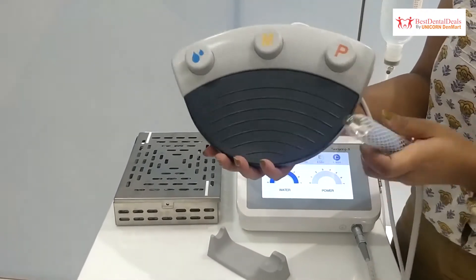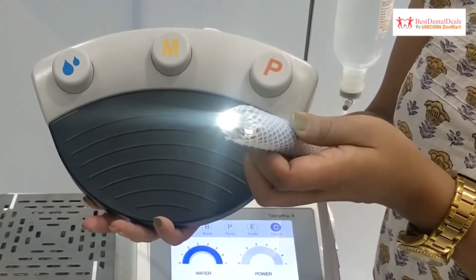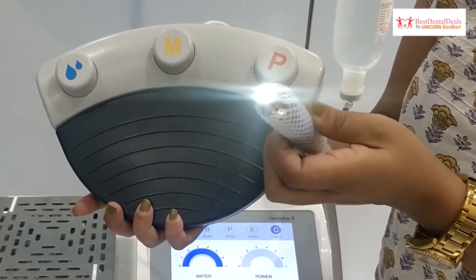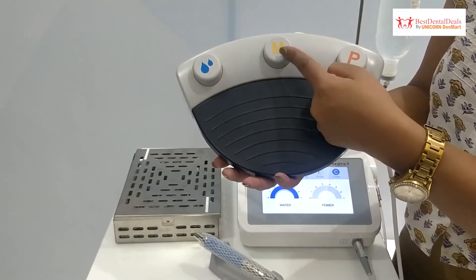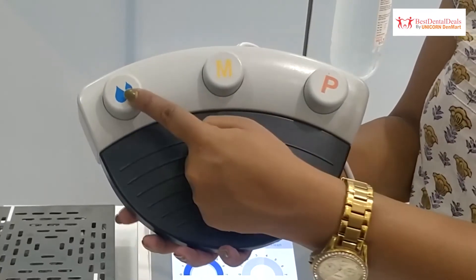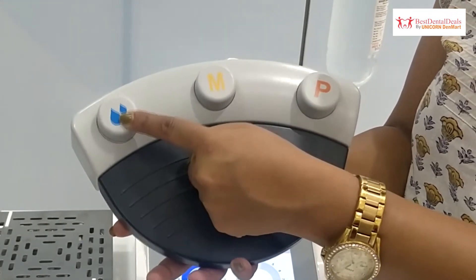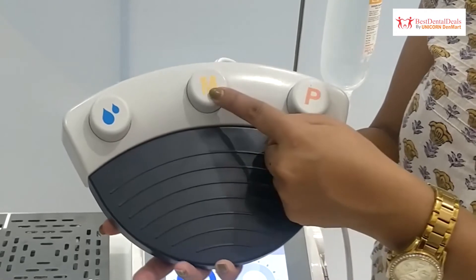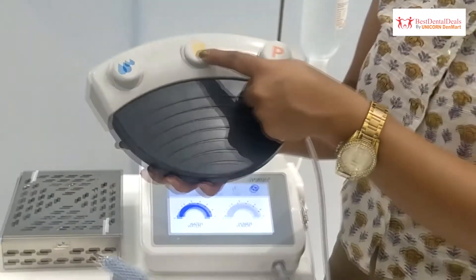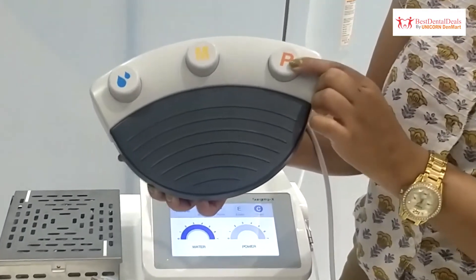The speed of the handpiece can be adjusted with the foot control without touching the screen. There are multiple options to control parameters through foot control. The first button allows adjustment of water flow for continuous operations. The second button is for selecting bone mode, perio mode, endo mode, or cleaning mode. The third button is for adjustment of power.